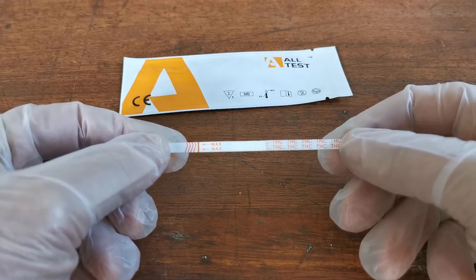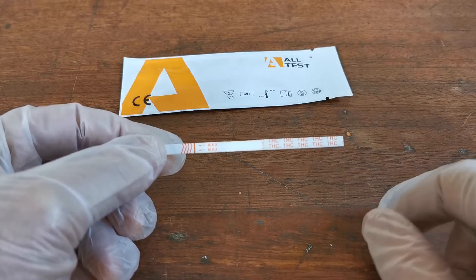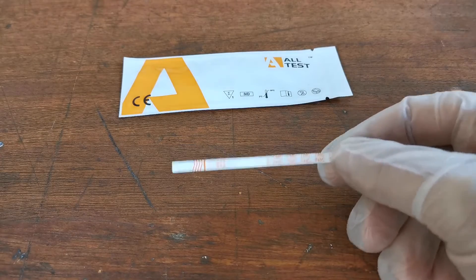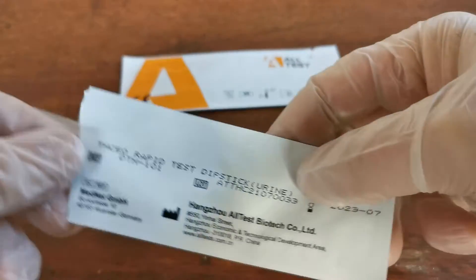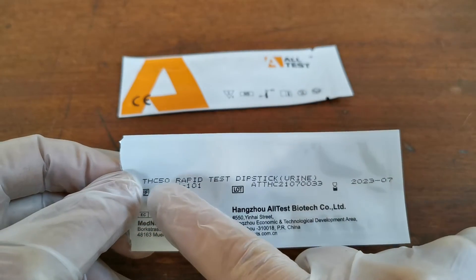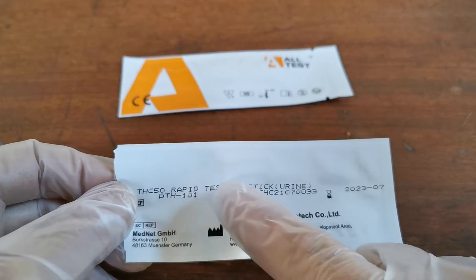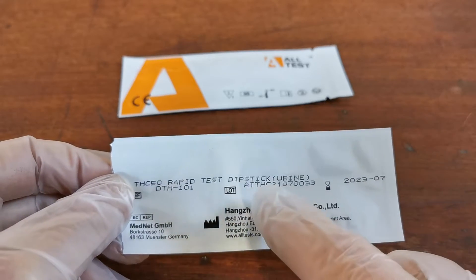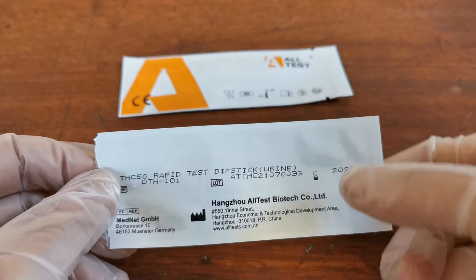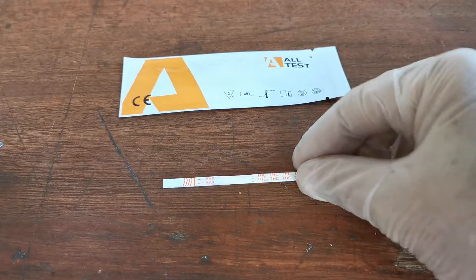There will also be a little pad of desiccant inside the foil to keep this in good condition. THC on the handle end is the coding of the drug test that you've purchased. On the reverse of the foil, the standard certification markings show the THC coding with sensitivity at 50, rapid test dipstick urine, a lot number, a catalogue product code, and an expiry date. This will obviously vary depending on the batch that you've purchased.